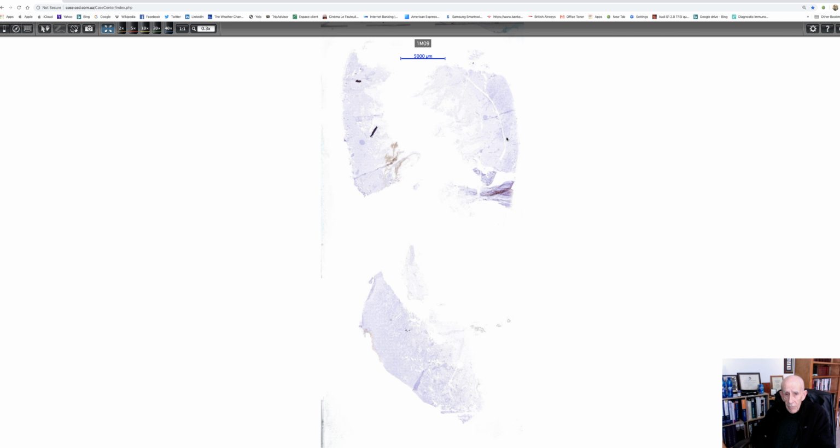Sometimes you see that histologically, but it's really quite uncommon to actually see a transition between one component and the other. Sometimes porocarcinoma can look very bowenoid. It can keratinize, and you have to look in the deep aspects to get more obvious poromatous tissue.